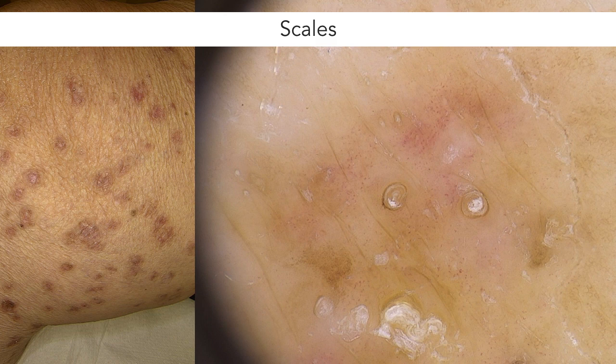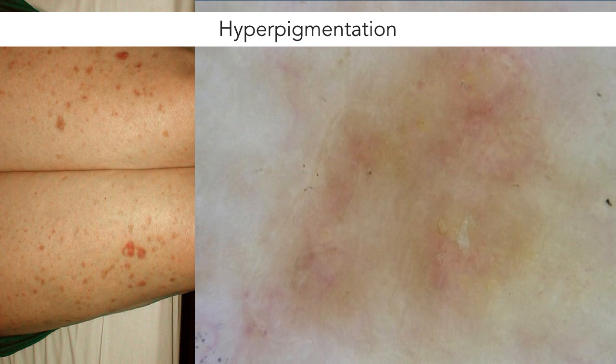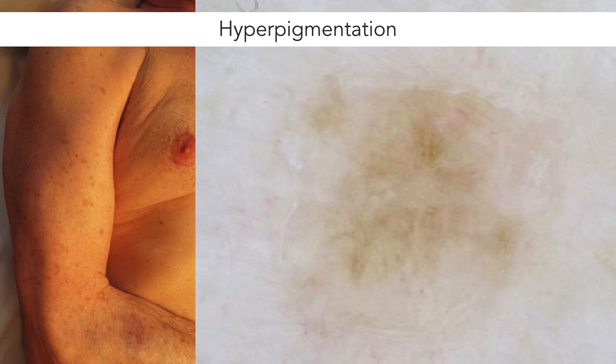Here's another case with scales within the central area. As you can see, there are also some peripheral areas of light brown hyperpigmentation. Hyperpigmented areas can be seen in some porokeratoses, such as in this case of DSAP. Here's one more case of hyperpigmentation in another case of DSAP.